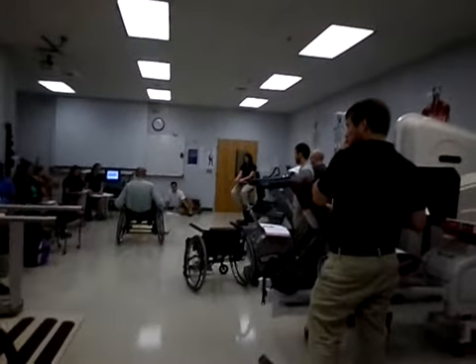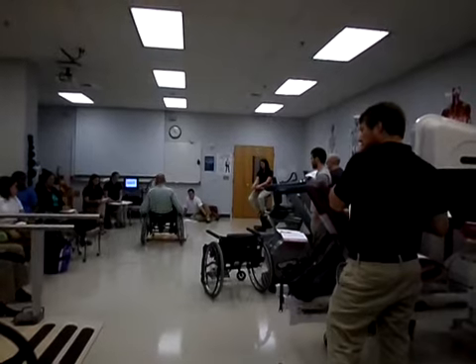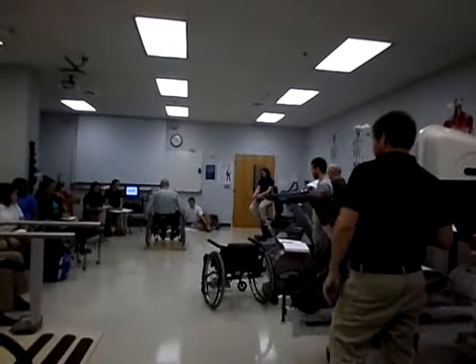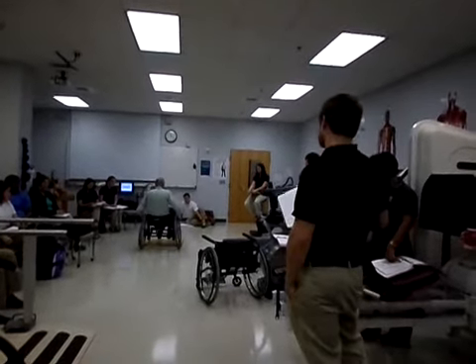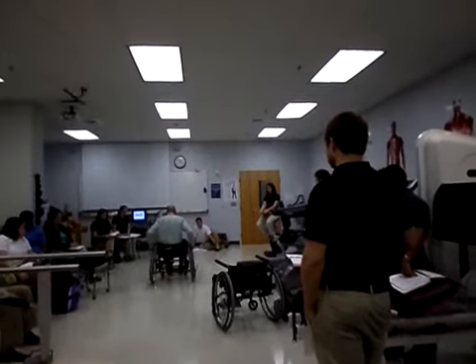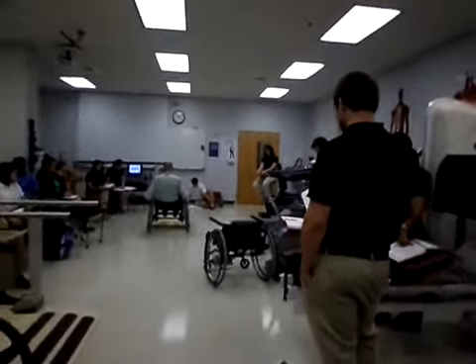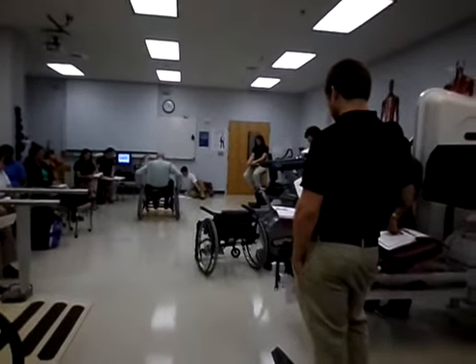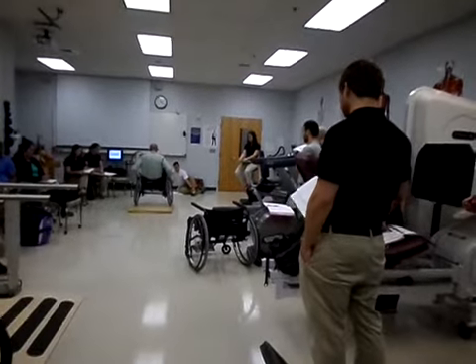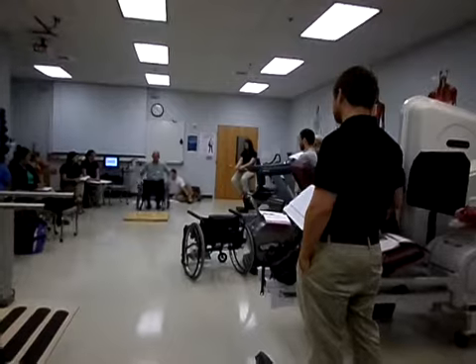The first thing you got to do is a wheelie. Get your wheels on there without slamming them down, and then push up on the curb. Okay, going down, it's easier going backwards and do a wheelie and come off of there. But you'll see on your notes, I think, also is going down the curb forward. So that's a little bit more tricky, so if we can do that. That works very smooth.